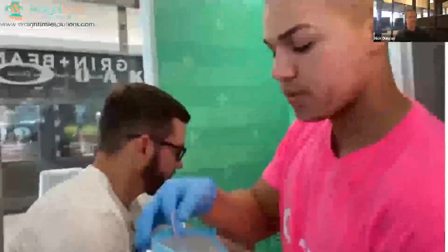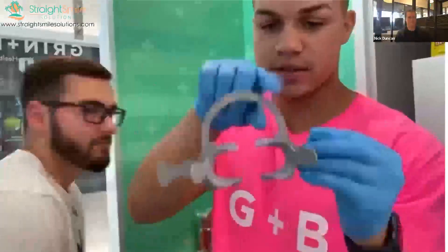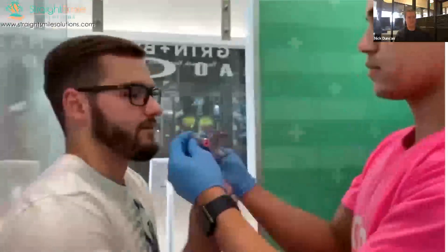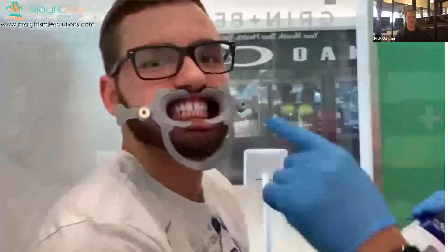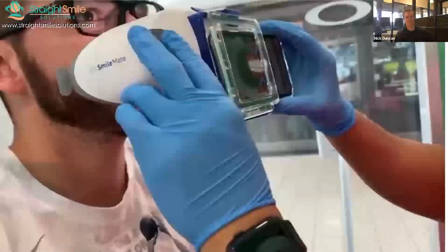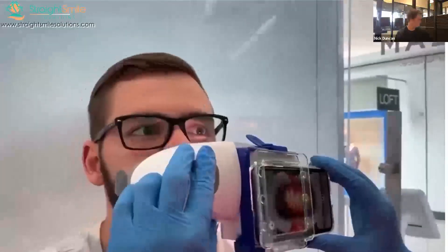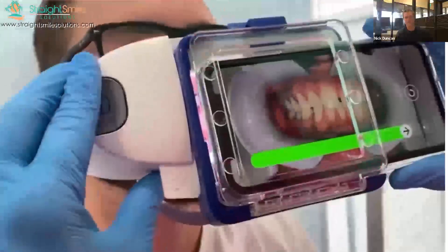Retract it and we're going to pull it out. We're going to make sure that this is facing down and that these are facing you. It should look like this — the magnet is facing you and then it clicks on.